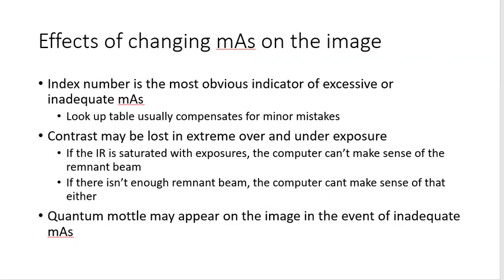And whenever you rotate from your current clinical site to a different clinical site, what you may find is that some of the equipment vendors have totally different index numbers. Some of them use a system where maybe a range of 200 to 400 would be normal and indicative of good exposures.